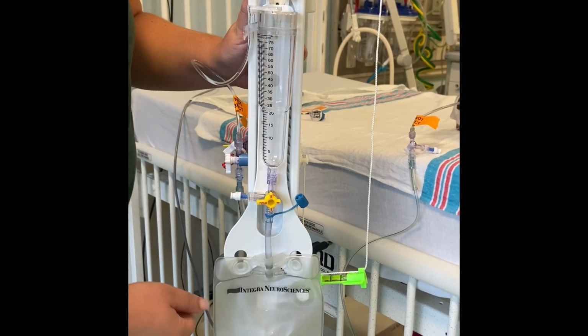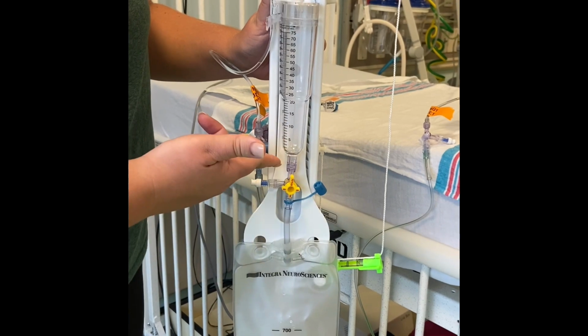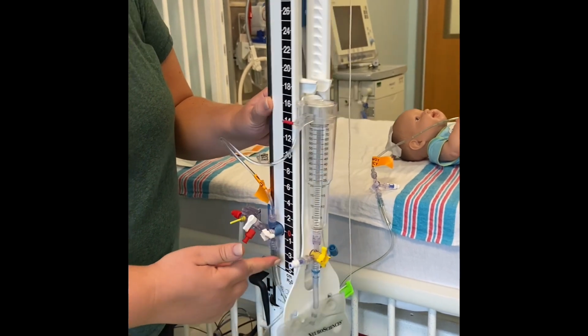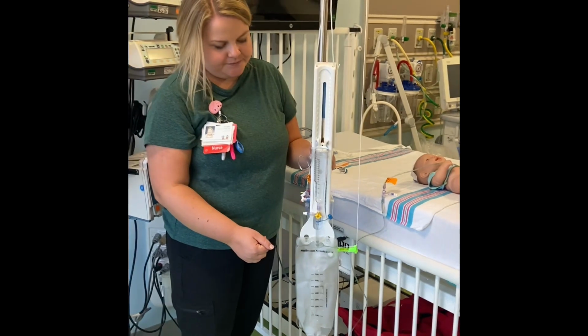Once the fluid has all drained into the bag, you can take your yellow stopcock, turn it back off to the buretrol, and then take your stopcock over here and open it back up for the patient. You now are reset for your next 2 hours.